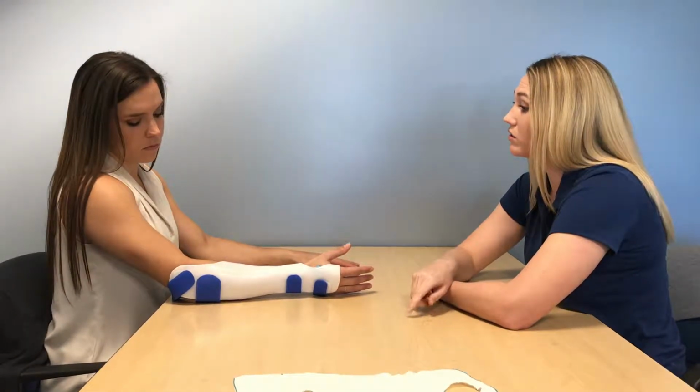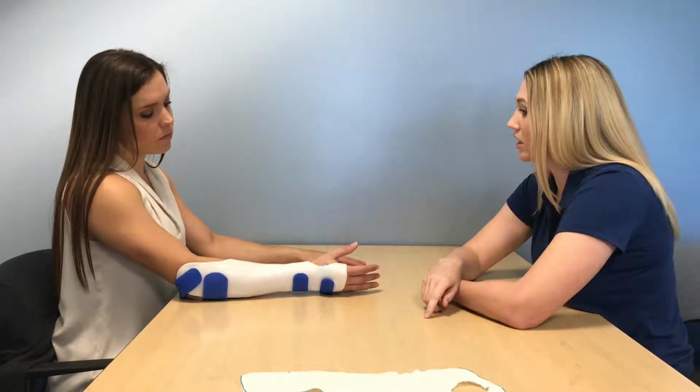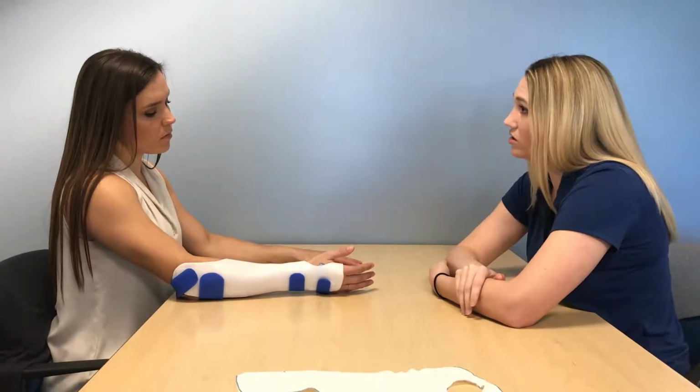You're going to need to wear this full time for the next 6 weeks. The only time you'll take it off is for cleanings. And do you have any other questions? No. Okay, great. Just give me a call if you have any pain or discomfort with it. Okay, thank you very much.